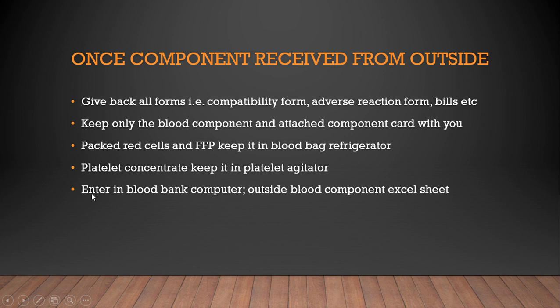Now document all these details in the computer. This is a part of our operating procedure, which I will discuss separately. This is also administrative work which a lab technician should know. Hope you are able to understand how the blood and blood components are handled in our lab.